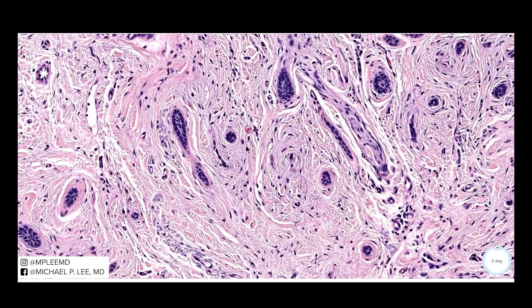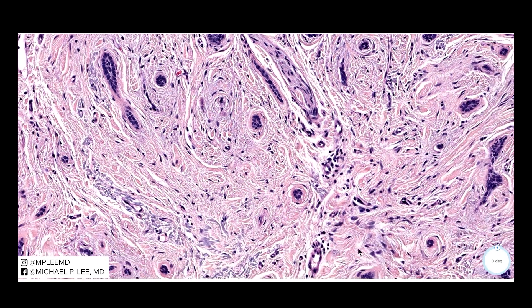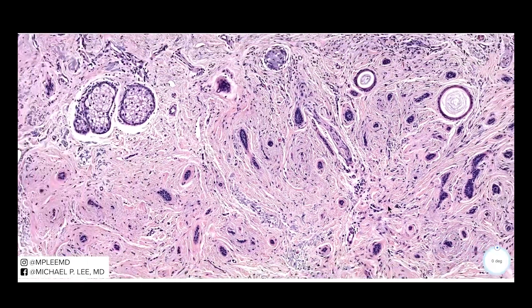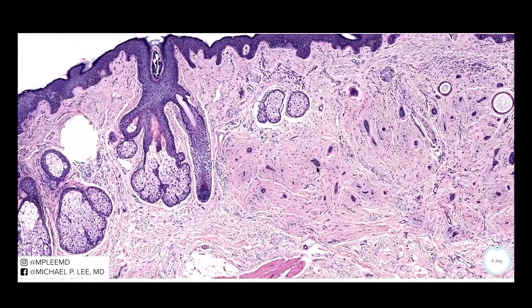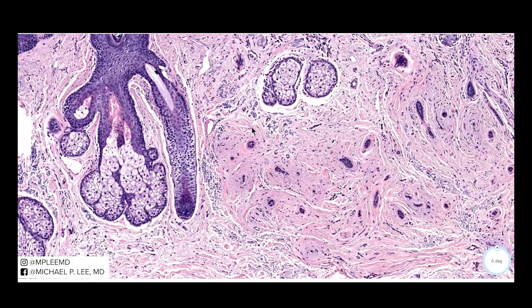This is different from microcystic adnexal carcinoma because we don't see any perineural invasion, we don't see the lymphoid aggregates, and it's a fairly well-circumscribed lesion with horn pseudocysts and calcifications. Here you can see more of that whirling pattern — the clefting occurs on the outside.